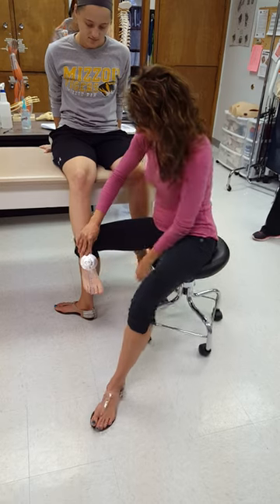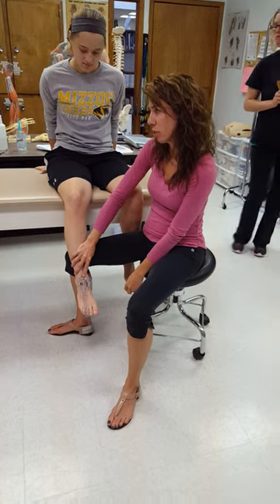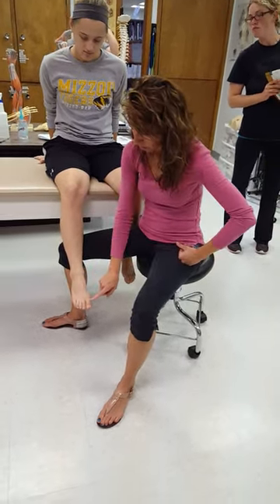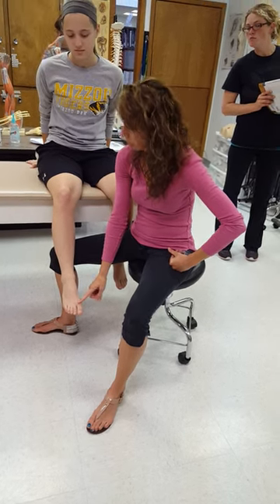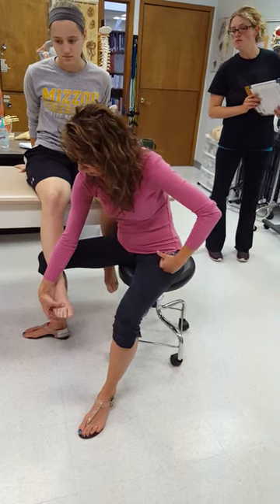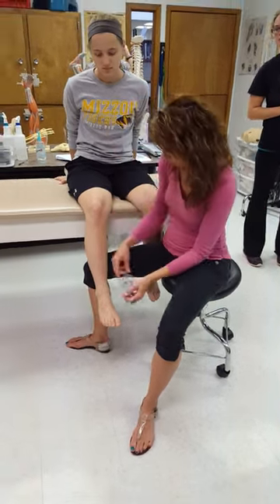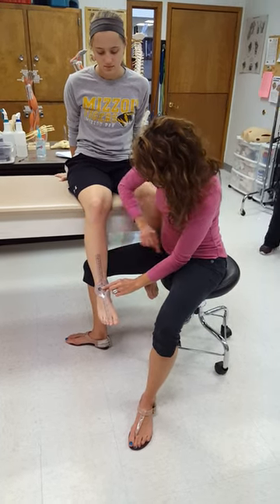Your movable arm is going to be lined up with the second metatarsal. Your first metatarsal articulates with the big toe, and the second one goes with the second toe, so you just find the second toe and palpate the metatarsal — the long bone in the forefoot.